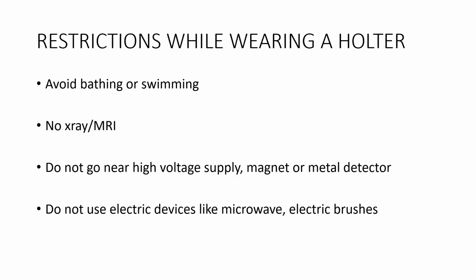So what are the restrictions while wearing a Holter? You should avoid bathing or swimming. This will spoil the machine. And avoid X-rays or MRIs. The patient shouldn't go near high voltage supply, magnets or metal detectors, and shouldn't operate electric devices like microwaves or electric brushes. This will interfere with the recording.